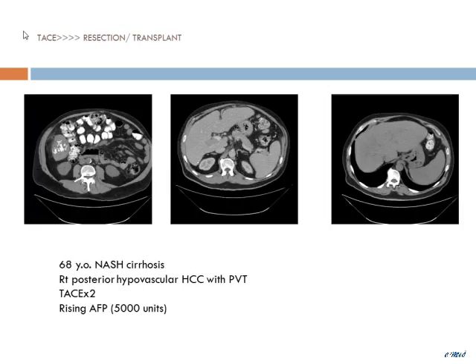I don't think anybody, like our previous speaker, will doubt that a patient on a transplant list who has a lesion amenable to chemoembolization should have that. This is a group of patients that undergo TACE when they're on the list. But another group is patients who are also waiting for resection, either as a definitive treatment, or a group of patients who are treated initially by TACE and then are offered resection as salvage treatment.